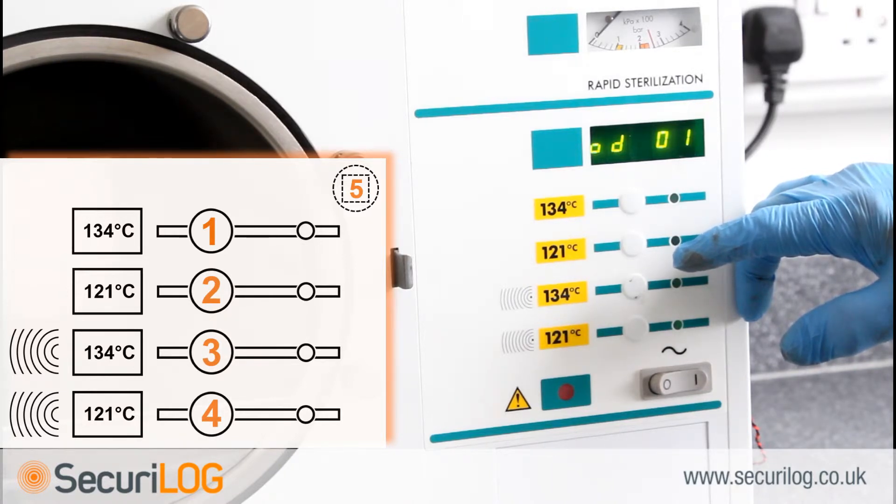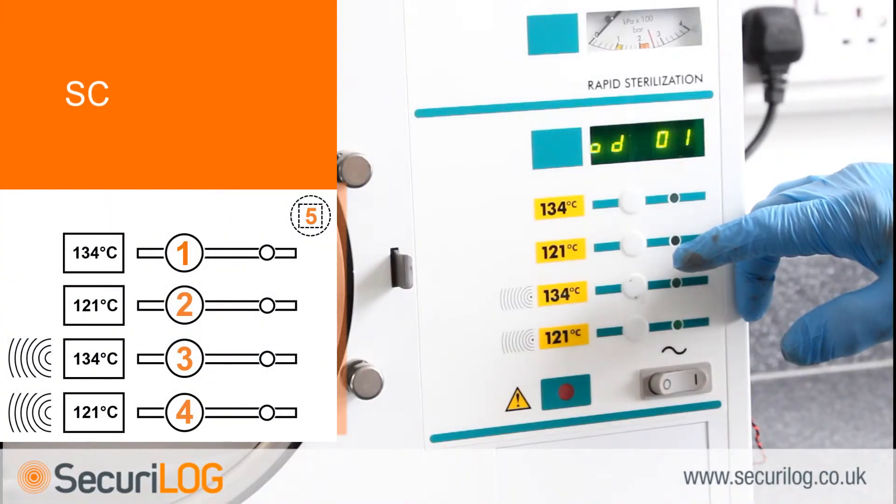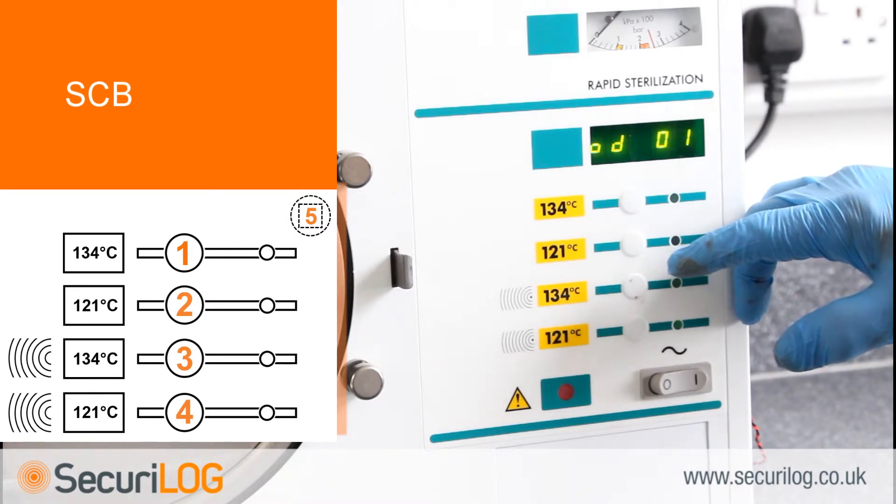The machine serial number must now be set. The autoclave serial number — found on the data plate on the inside of the autoclave door and on the back of the autoclave cover — comprises four parts. The first part to set is the modification state, made up of three letters; however, only the third letter is used. The letter is represented by a two-digit number: A is 01 through to Z at 26.